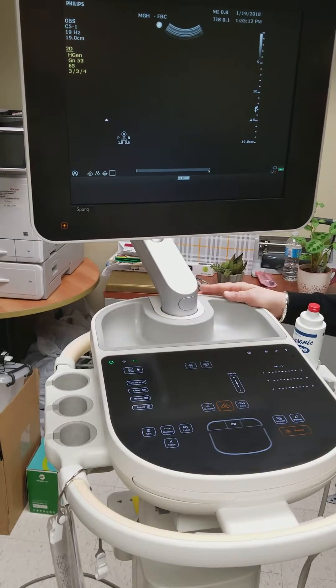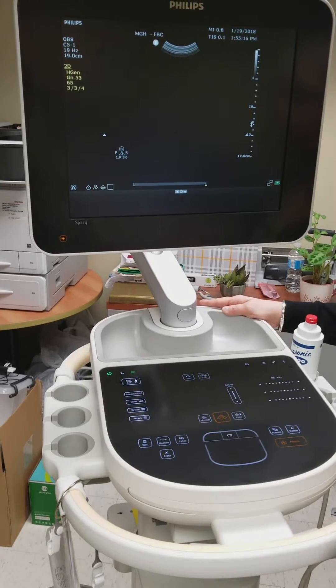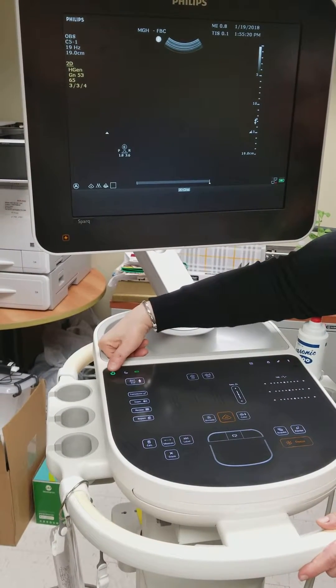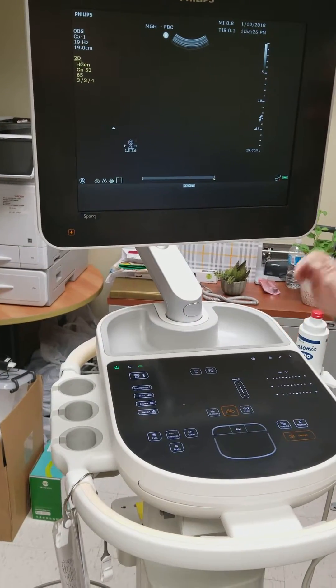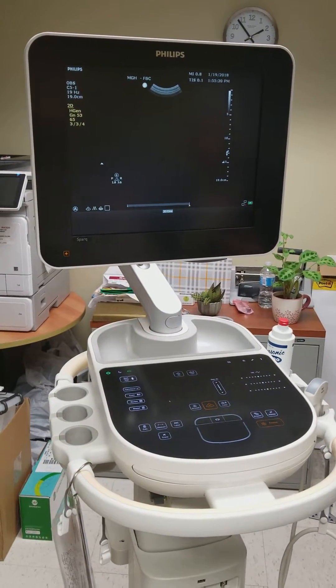To turn it off, it does take two minutes to power down and another two minutes to power up. What you're going to do is, using your thumb, just press this key down and it'll turn off, and then you can turn it back on. I'm not going to do that now because we don't have two minutes to wait.